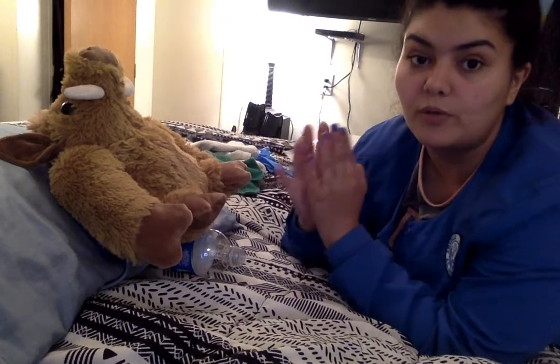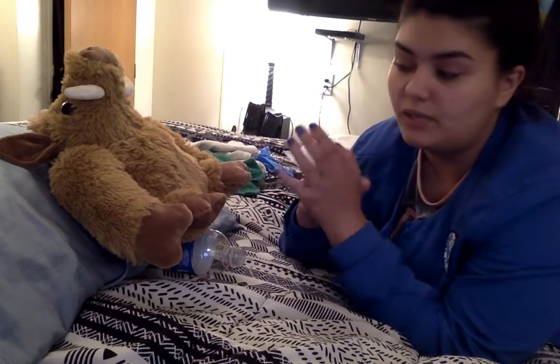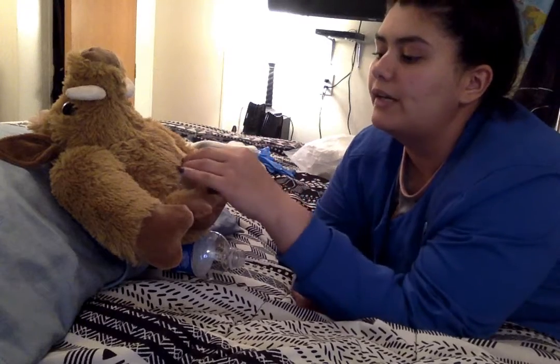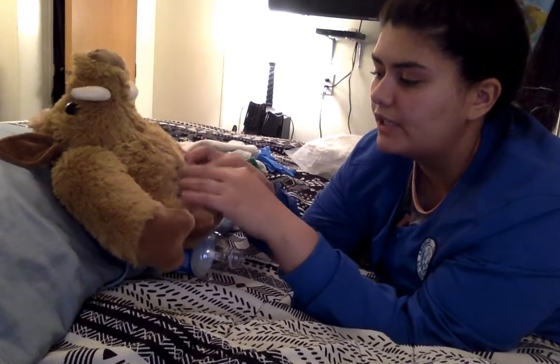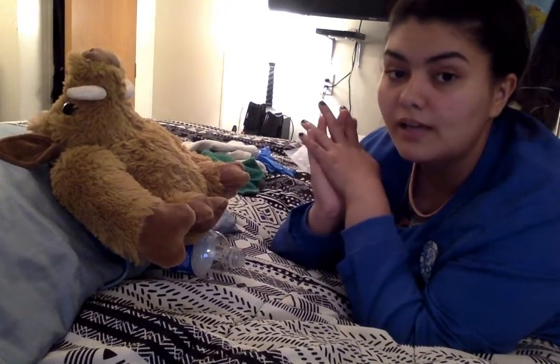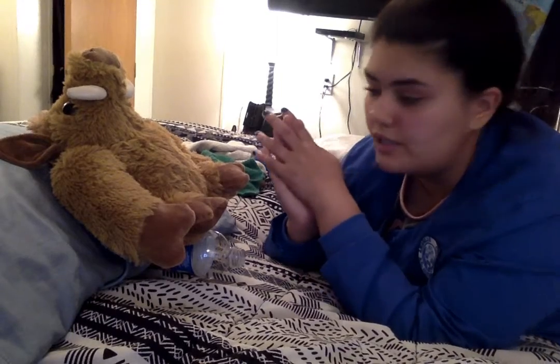Next thing I'm going to do is go find the bladder scanner. I'm going to scan her bladder. If I couldn't find the bladder scanner, I could also palpate her bladder. And yeah, she definitely needs a urinary catheter to get rid of this distension.